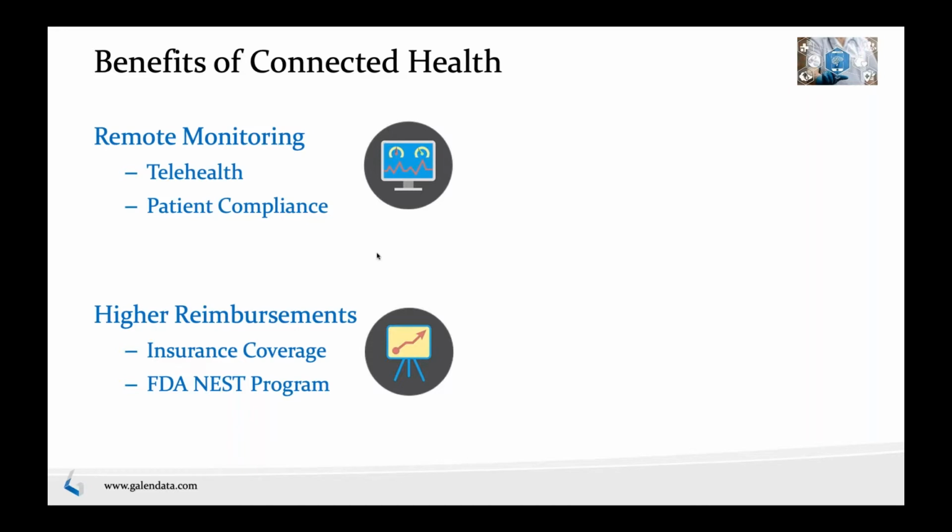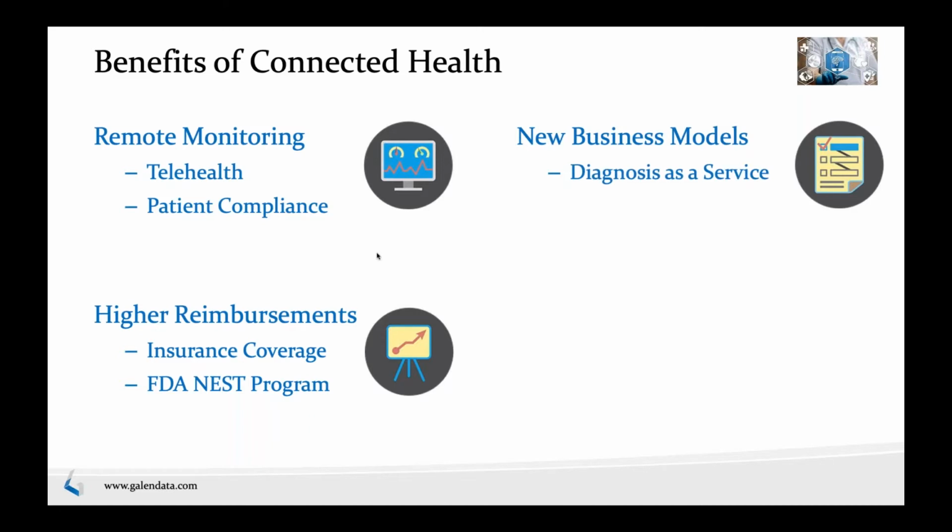With this pilot program, you can do that while the patients are using your devices for the approved use cases. So that's another very cost-effective way to get additional coverage. Connectivity can also open up new business models, such as diagnosis as a service.